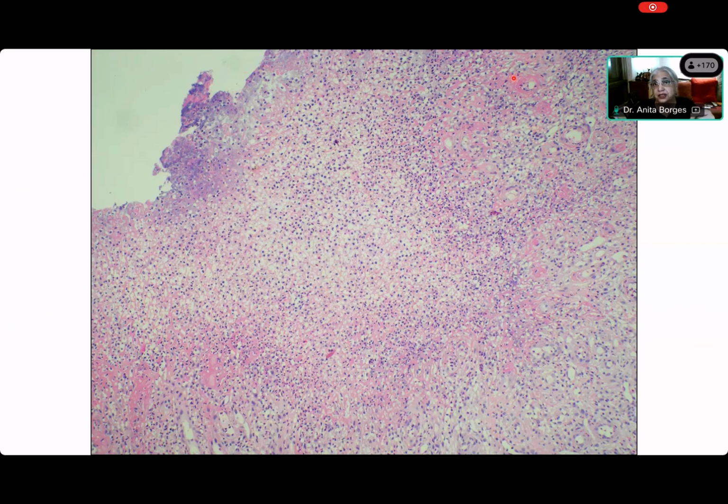What are these? You actually see this pink stuff that is surrounding the blood vessels, and that also is fibrin. Okay, and this fibrin is coming out of leaky blood vessels. Now, those leaky blood vessels are obviously capillaries, which are newly formed capillaries. And so it's leaking fibrin, and along with it, you are seeing the polymorphonuclear cells. Okay, there are more mature capillaries that are being seen at the base of this particular section. Okay, see that so clearly.